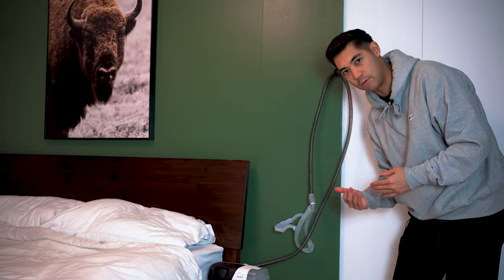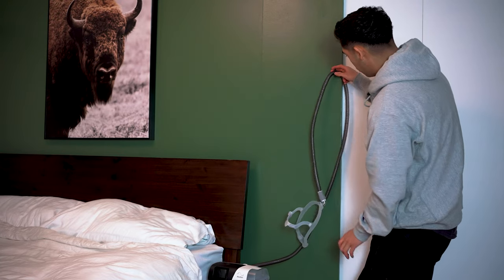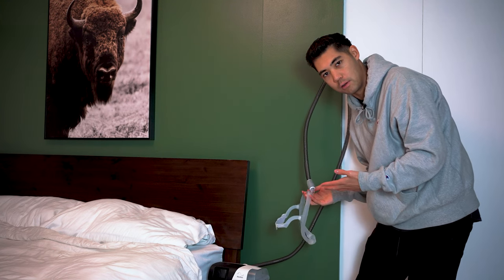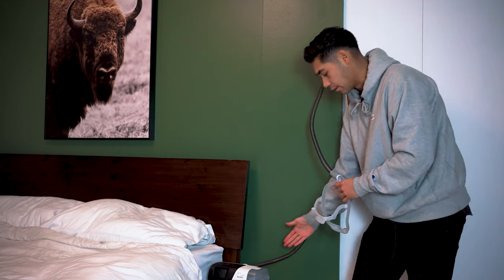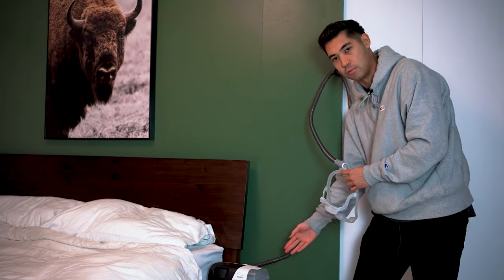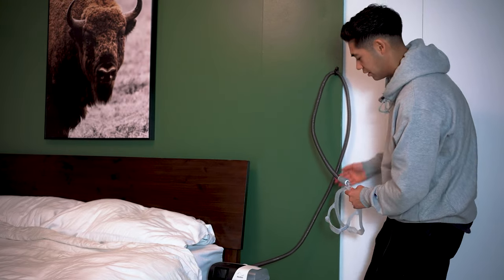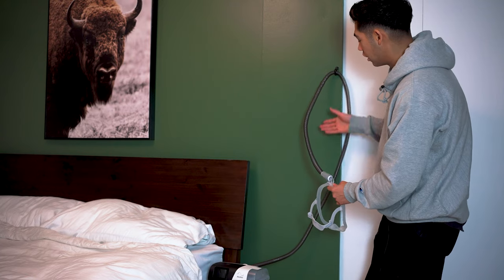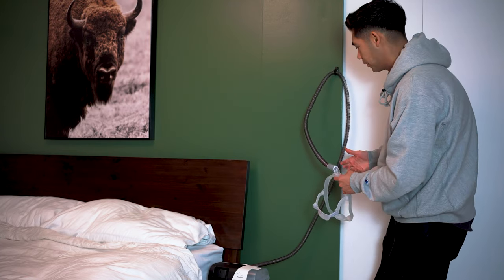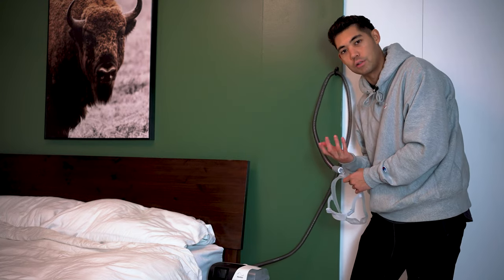The tube hook has a few different benefits. The first benefit is it decreases the weight of the tube — all the weight is supported, so it's a much lighter sleeping experience. The second thing is that most of the water that condenses in the tube is going to run back into the machine and not down into your face. For example, if roughly 60% of the tube runs toward the machine and 40% toward your mask, the water droplets from that 40% will reach your mask, but it's still a huge decrease.